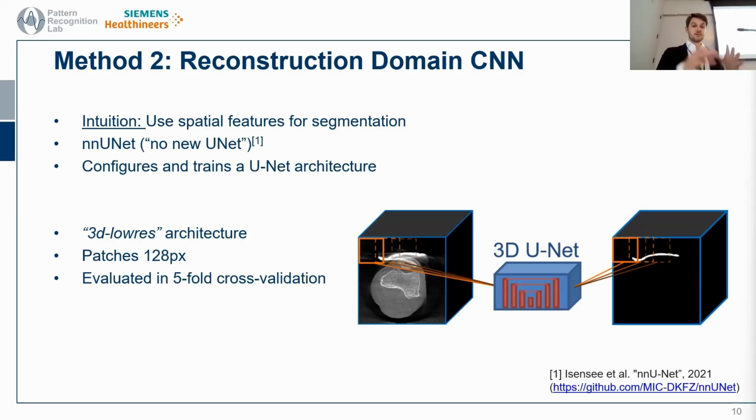So the full resolution volume is chopped up into sub-volumes, which are then individually predicted and then stitched together back. And actually in the implementation of this training that I use, I guess there's a bunch of pre-processing steps like random flips and so on of the sub-volume to increase model performance. So I would have to have a deeper look at how you could cut the inference time, which I'm sure is possible somehow. Okay. Thanks.